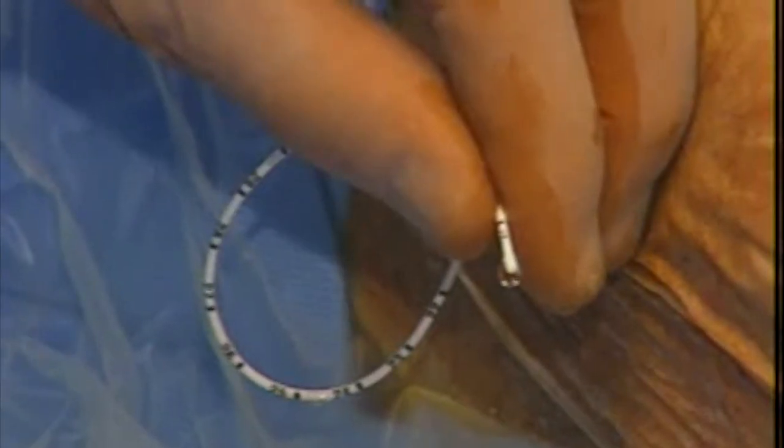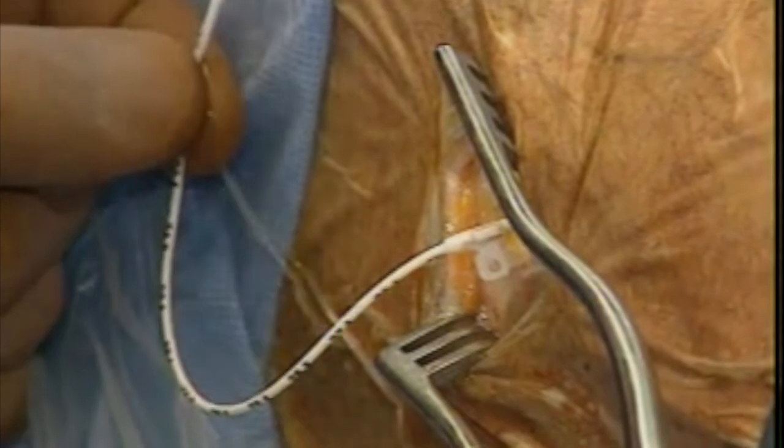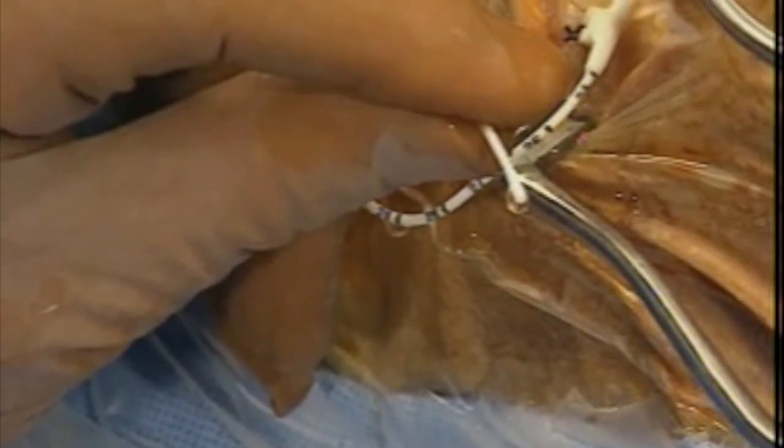After confirming CSF flow, thread the V-wing anchor onto the distal catheter segment and clamp the end of the catheter to the drape above the incision site to prevent CSF leakage. Confirm catheter patency for CSF flow after ligature placement.